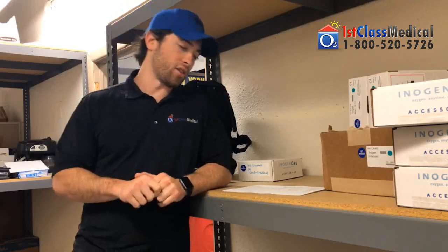So the continuous flows are measured in liters per minute. So you have like 1, 2, 3 liters per minute. Just so you guys know, the portable oxygen concentrators, where we're at with technology today, the highest that they offer is 3 liters per minute continuous. So if you're anything higher than a 3 continuous, unfortunately they don't have anything in a portable oxygen concentrator unless you can use a pulse flow. But continuous flow is measured in liters per minute.